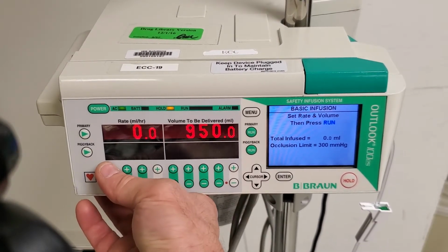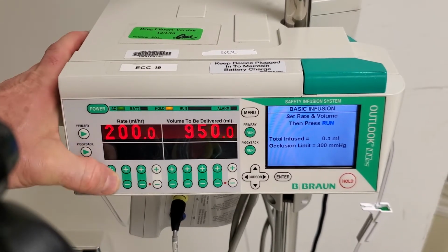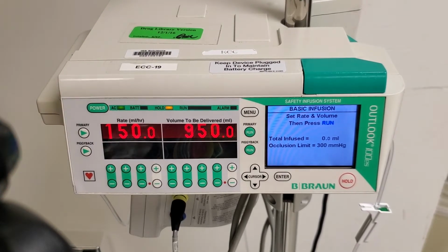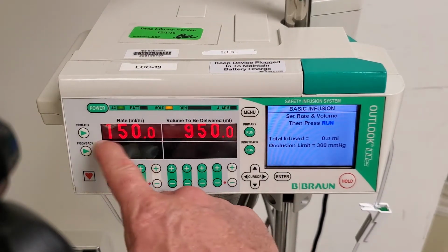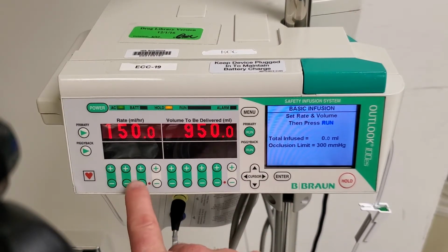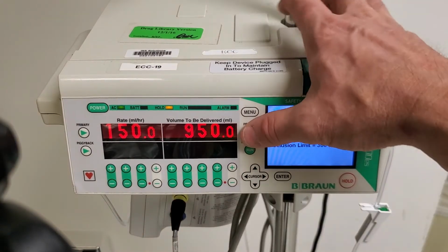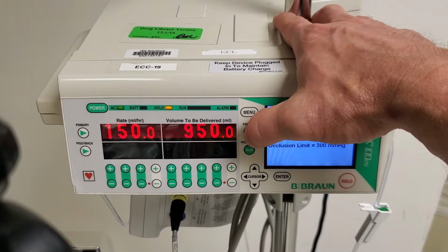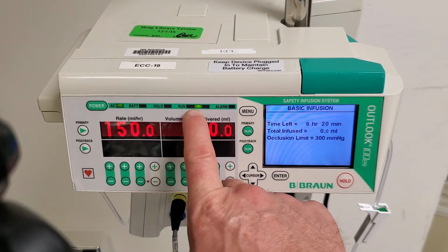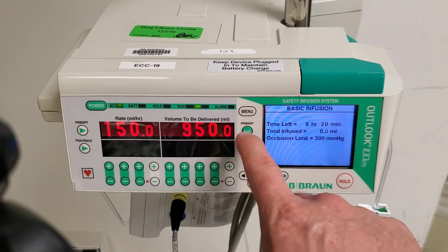Select a rate, mLs per hour to be delivered. That'll be whatever the doctor orders or whatever you feel is appropriate. We'll set it for 150 mLs. Anytime you make selections on these screens, you use the plus and minus keys beneath the decimal places. Once you've made a selection, you have to hit run to confirm it. Now the pump is running, 150 mLs an hour, volume to be delivered 950.